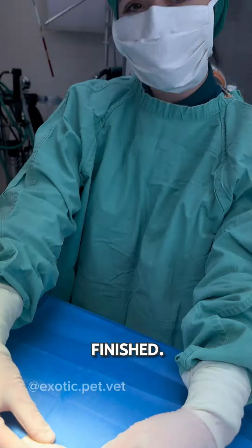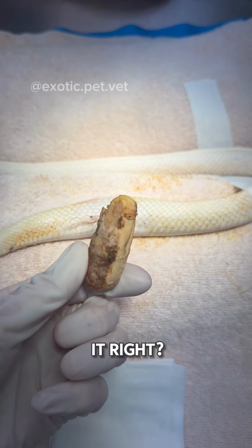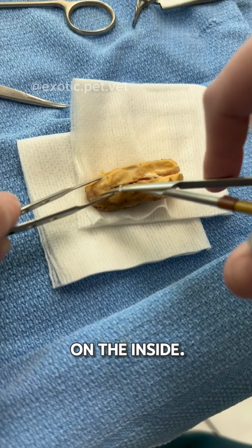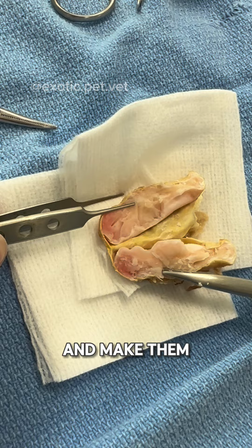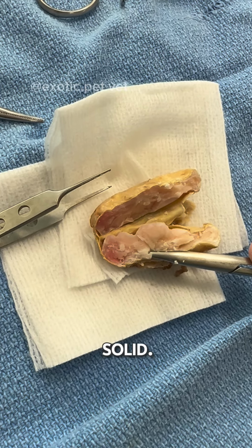Finally, we were finished. Here's most of the egg after it was removed. I bet you want to see me cut into it, right? Well, I'm not going to leave you empty-handed. Here's what the egg looks like on the inside. Sometimes you may see people try to use a needle to deflate the egg and make them easier to pass, but there was no way this was going to happen with an egg this solid.